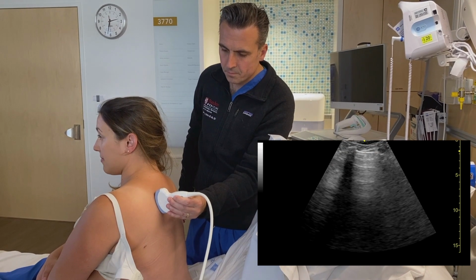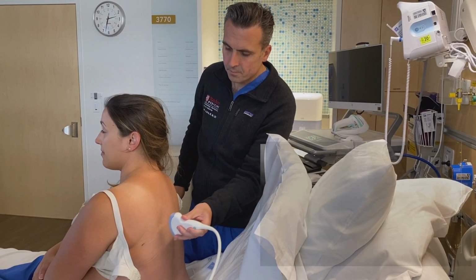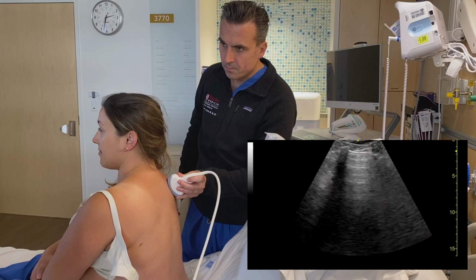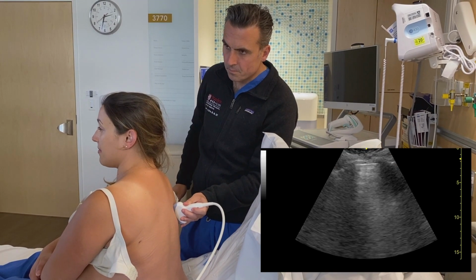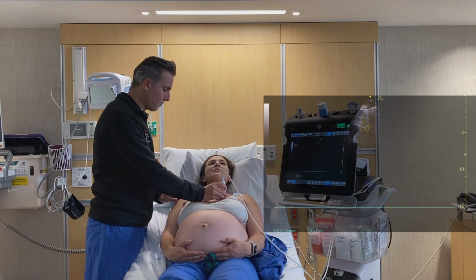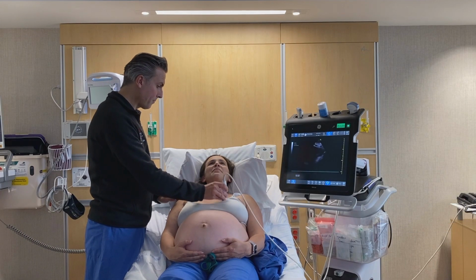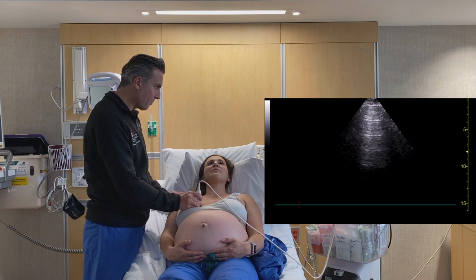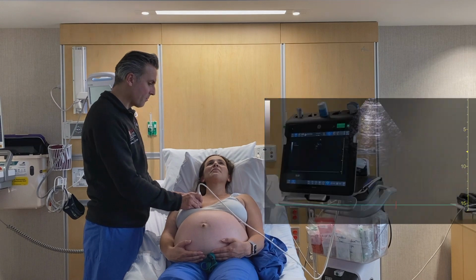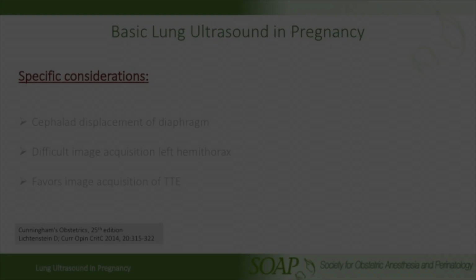In the evaluation of interstitial syndrome, 3 other methods have been described. The 12-region technique, including 2 lung regions on each side of the patient's back, the more rapid 4-region technique, sufficient in some acute scenarios and assessing only 2 lung regions per patient's side, and finally, the most comprehensive technique is the evaluation of all 28 rib interspaces.